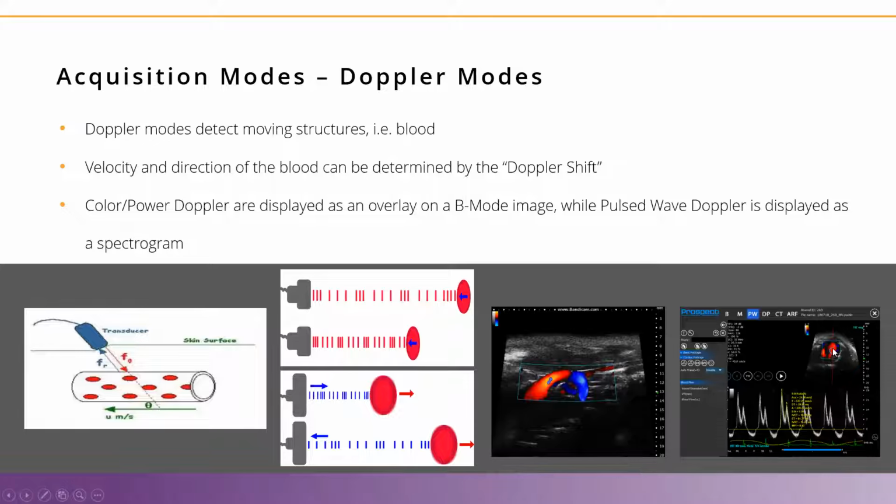And here we're specifically looking at the jet coming through the mitral valve. So going from the left atrium into the left ventricle. And this is a very characteristic waveform of that flow velocity. And we'll talk more about this when we look at specific images of cardiovascular function. But for those of you who do this work routinely in your lab, you'll recognize this right away with the full measurement package to assess diastolic function.